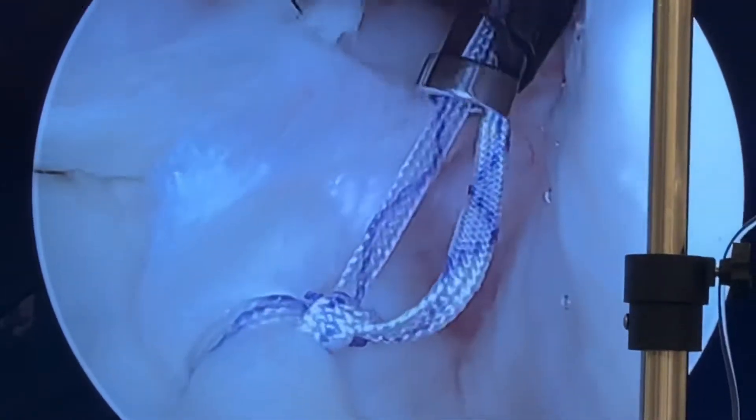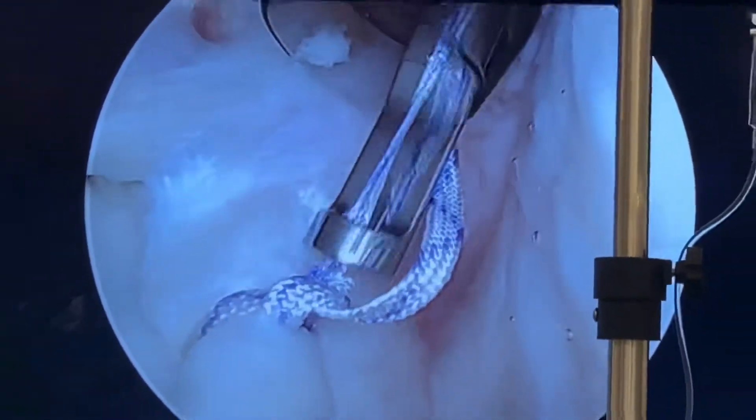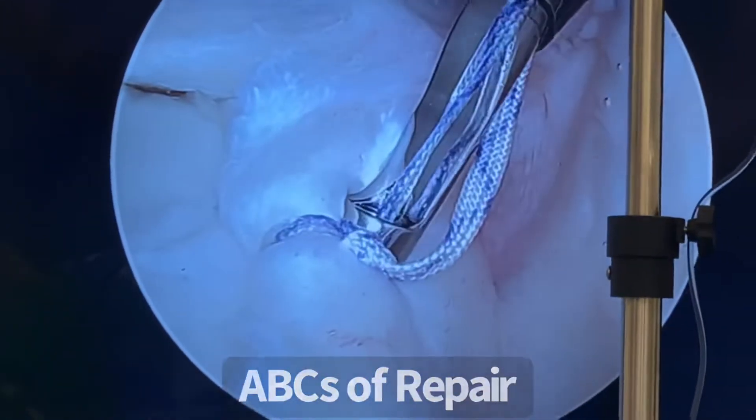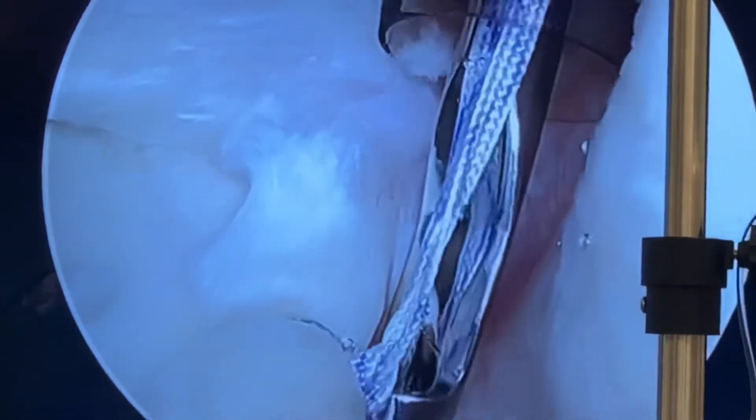Compress just enough — you don't want to choke, you don't want to strangulate, you just want to compress. Compress it up against the bone nicely like that, and then we lock it in, just like that.